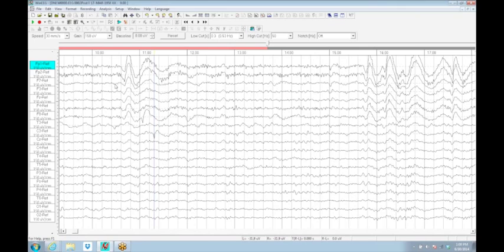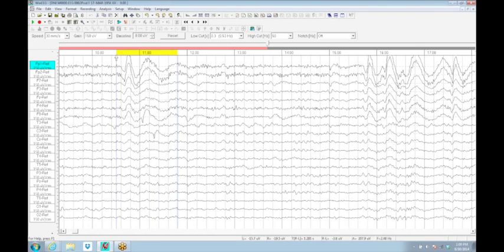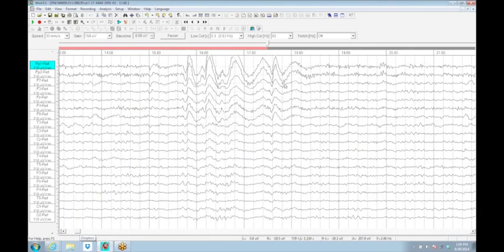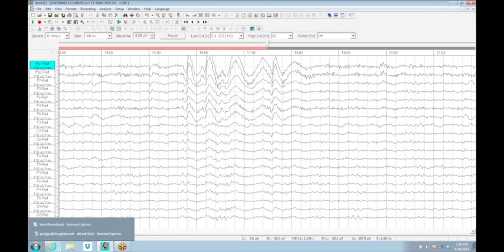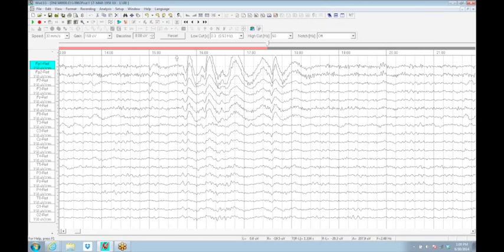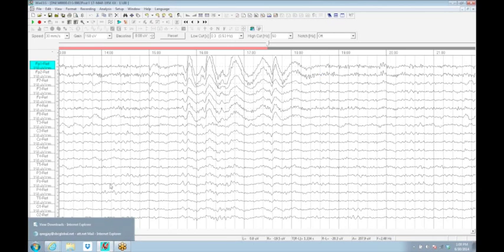You can set up the EEG to mark all of these and remove them, or you can alternatively extract the eye movements, leaving the rest of the EEG intact. You can mark these in the older way of removing artifacts and clipping them out one at a time.